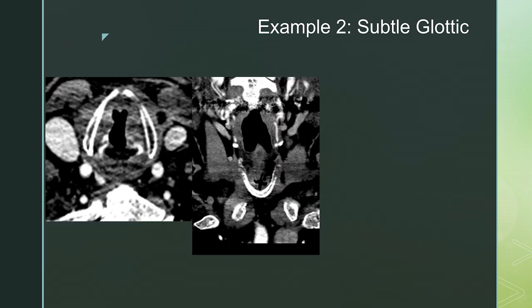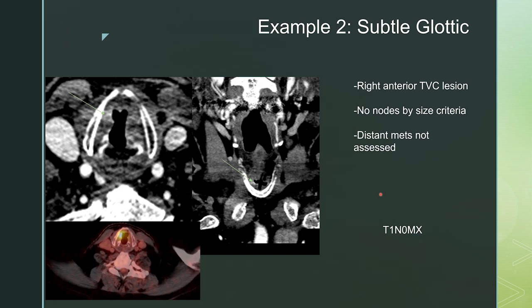For example two, we have a subtle glottic lesion. If you window down, you can see there's a hyperdense appearance of the right anterior cord — the anterior third is hyperdense compared to the left — with a little volume loss of the cord. On the coronal view, you can see the ventricle and the superior surface of the cord with asymmetric hyperdensity compared to the left side. This is a right anterior true vocal cord lesion, no nodes by size criteria, distant mets not assessed — T1N0MX. On the PET scan, you can see it is hypermetabolic.